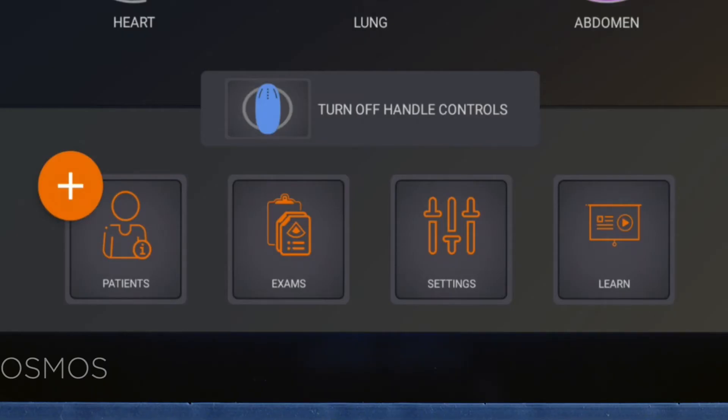Along the bottom of the screen are icons to add patient information, review prior exams, access your bridge settings, or learn more about Cosmos and how it can help elevate your bedside care.